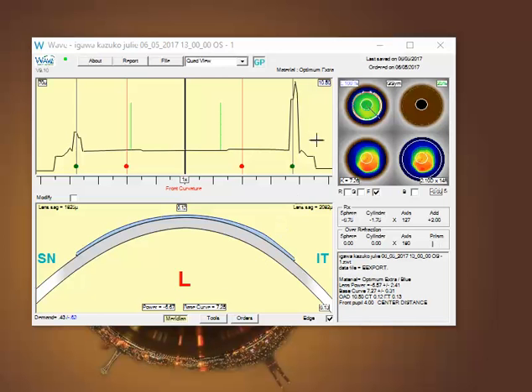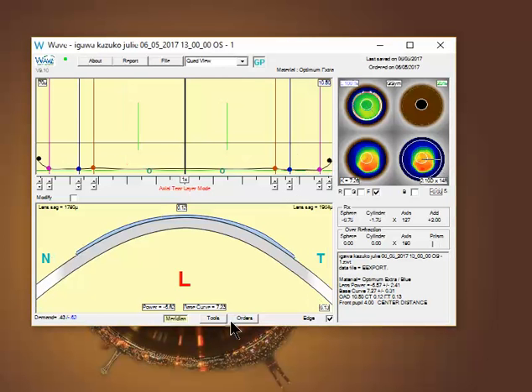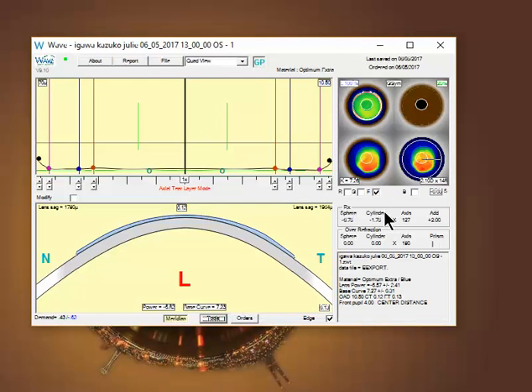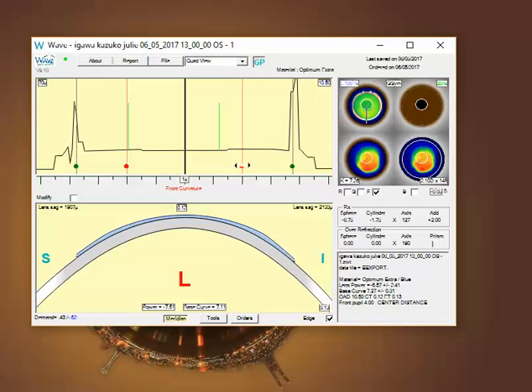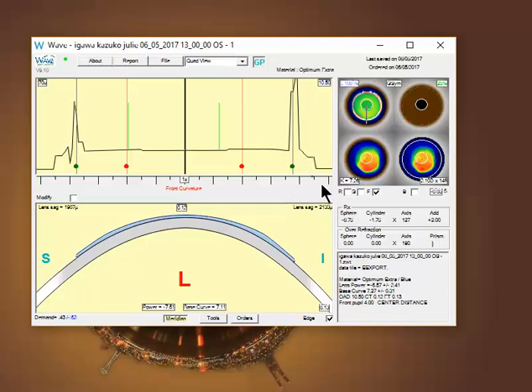So with those subtle changes—going a bit larger, realigning using current settings, and keeping the bifocal zone as large as possible to ensure the bifocal does not interfere with distance vision—that should ensure a better centered lens.